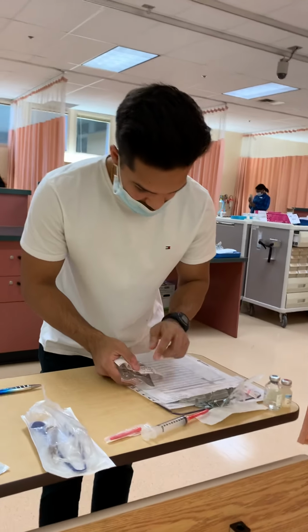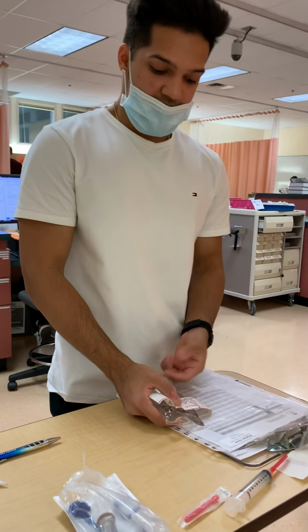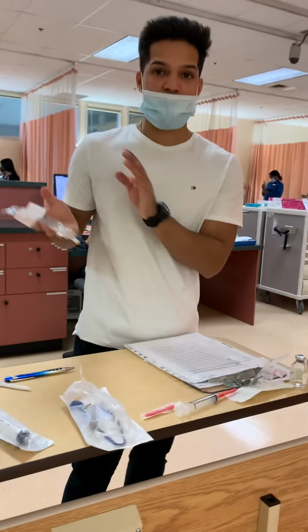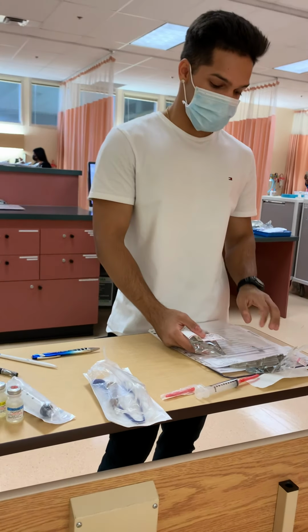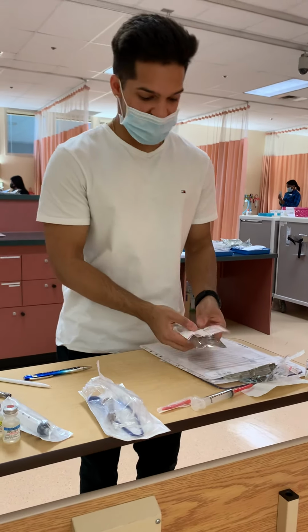And once it's fully diluted, I'll be putting my label on my bag, and making sure I have everything right. This is for Ricinema. The medication we're giving is cloxacillin. The dose we're giving is 1 gram, and the vial did come in 250 milligrams per mL. Therefore, I have added 4 mLs in this 100 mL bag. So our total volume in this bag is 104 mLs. And the route is IV. This is an IV mini bag, and time frequency is every 6 hours, not given yet, signed off for at 0600 on October 20th, so I will be giving it. Okay, so now I've clarified everything.